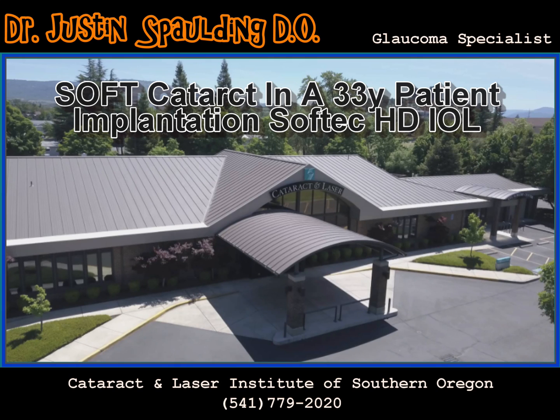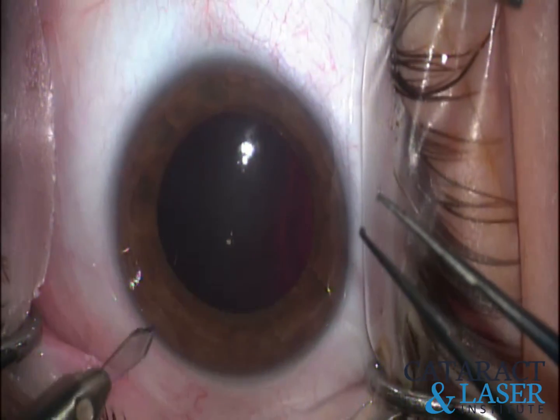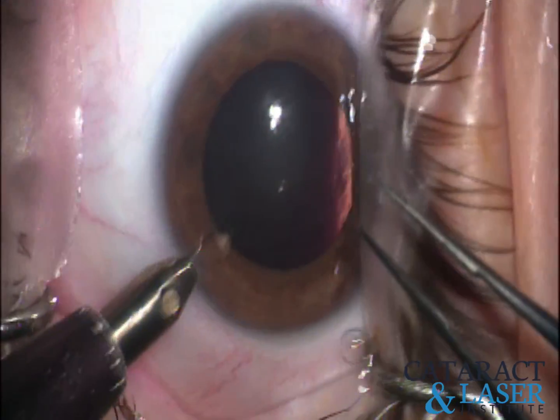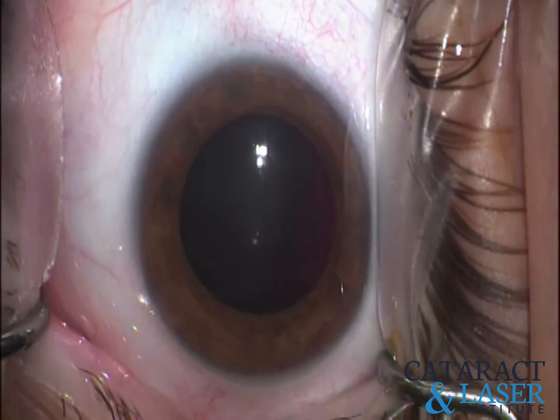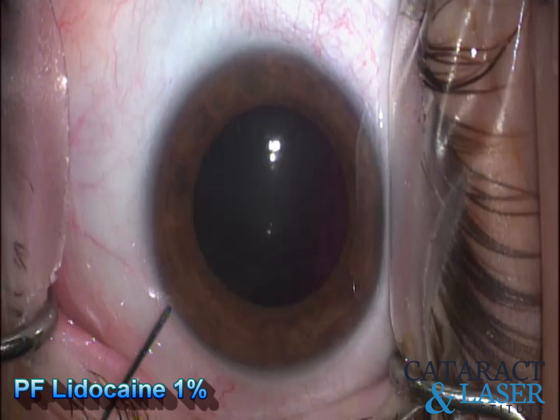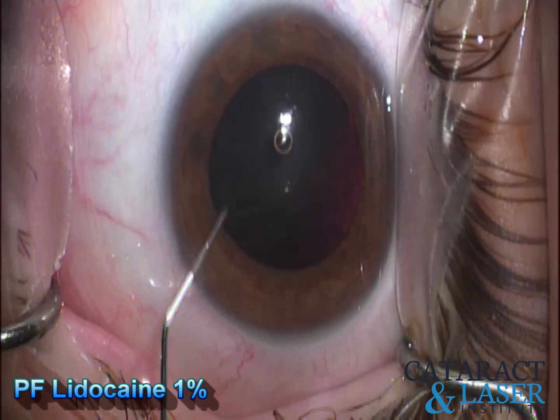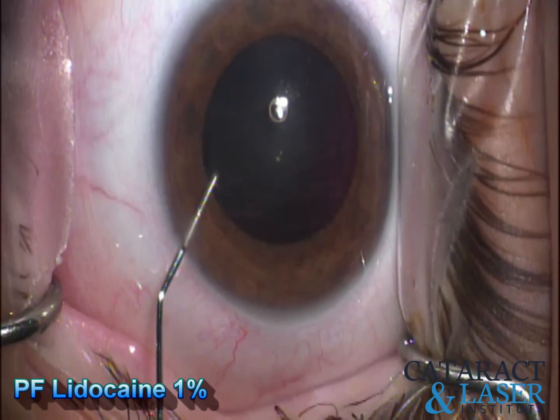This is a nice example of a technique to remove a soft cataract in a 33-year-old patient. First thing I like to do is use that 1mm diamond blade — this is what creates my paracentesis, what we'll be using all the secondary instruments out of. I do like to use preservative-free lidocaine on all my cataract patients; it just makes them more comfortable for the entire procedure.